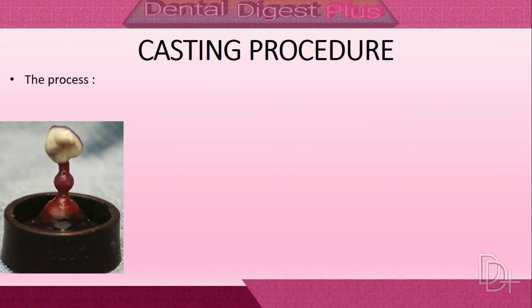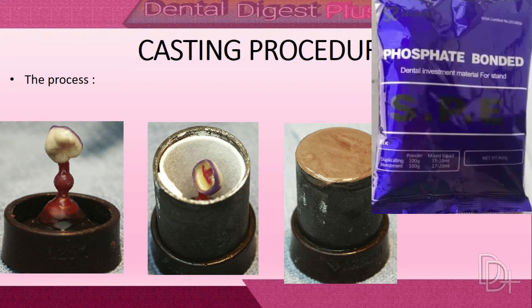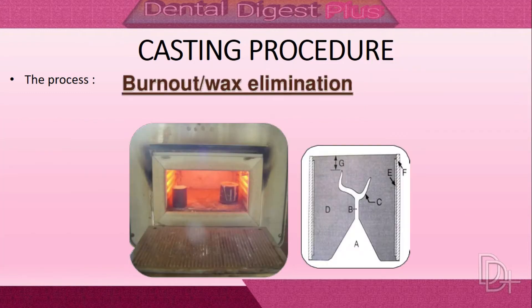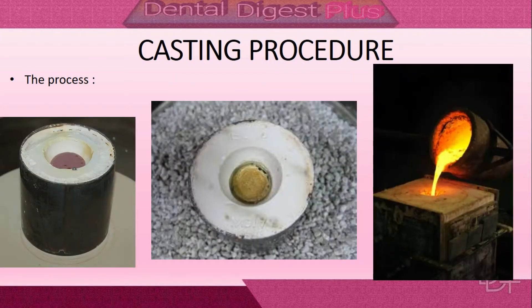This process consists of surrounding the wax pattern with a heat-resistant investment material, after which elimination of the wax is done by heating the casting ring in the oven, and then introducing the molten metal into the mold through a channel called sprue.